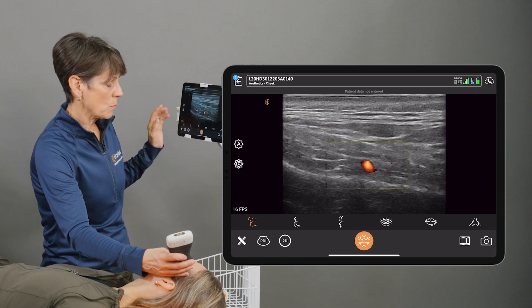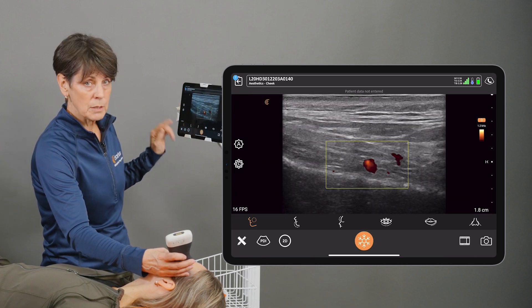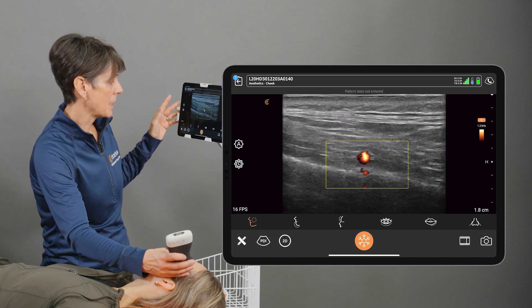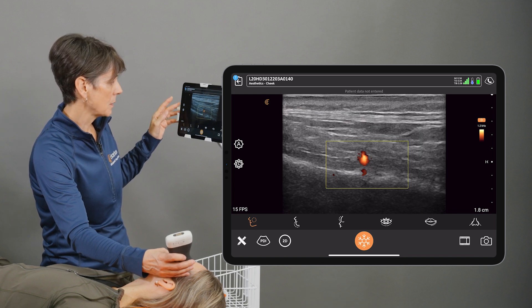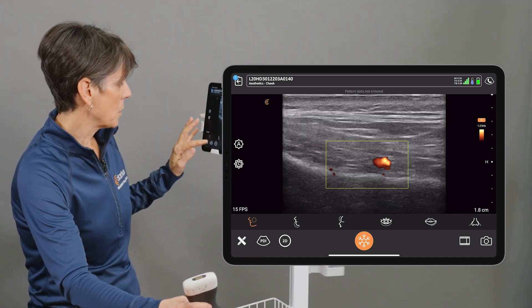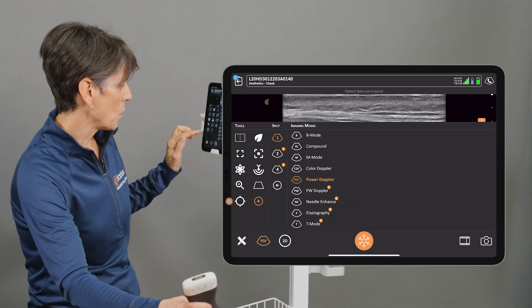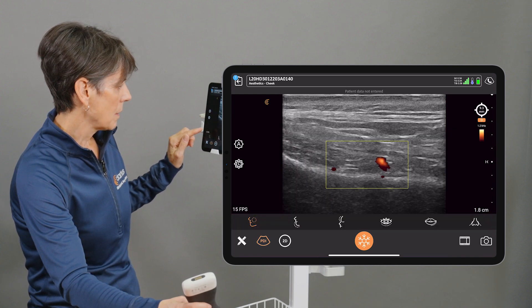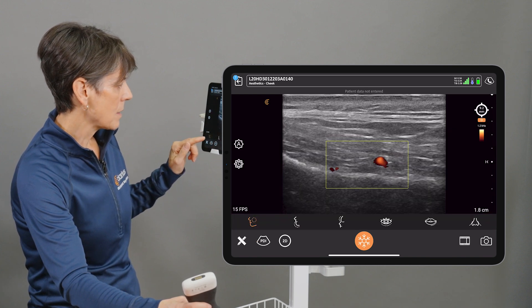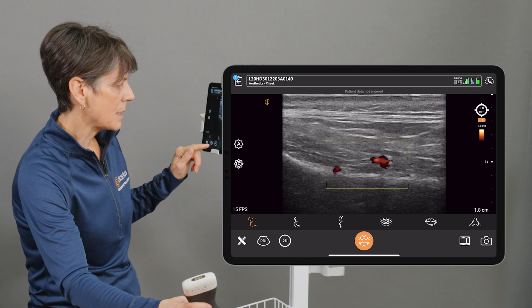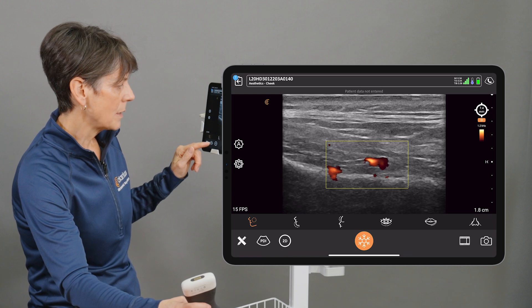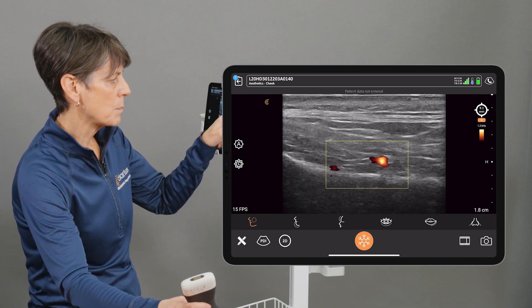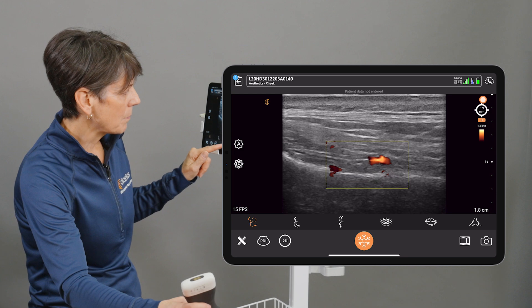Now there's one more trick you can use on the Clarius app to establish the depth of that vessel. If we enter into the tools menu once more and I click on this little icon, that is going to automatically detect the depth of that vessel from the skin surface and display it, updating it in real time.